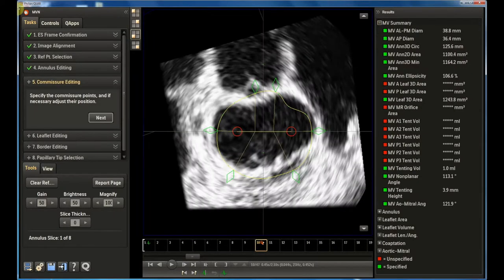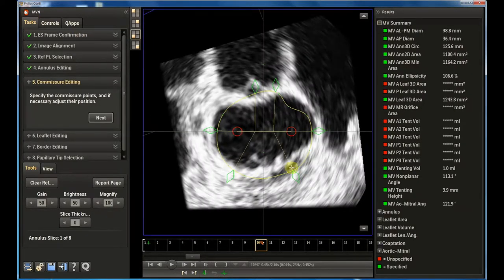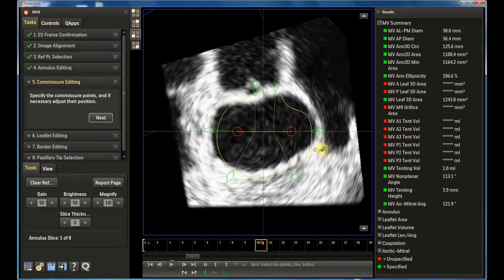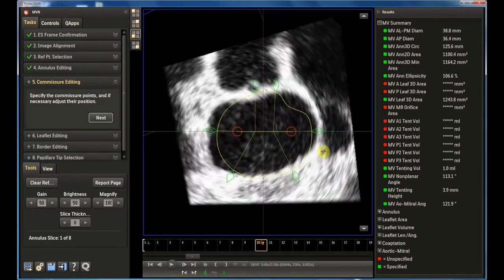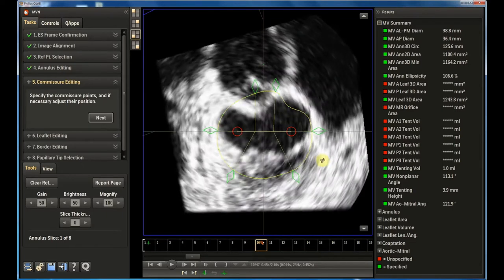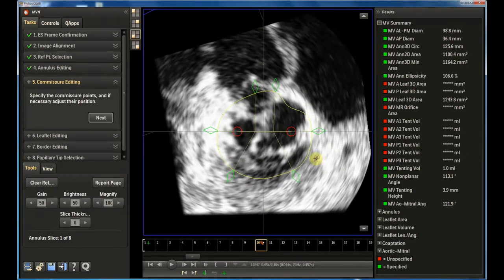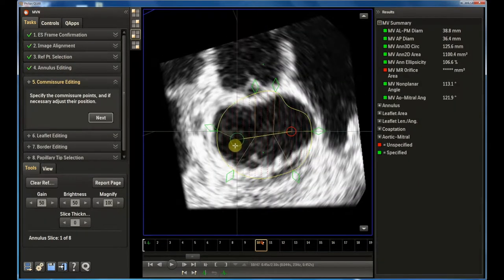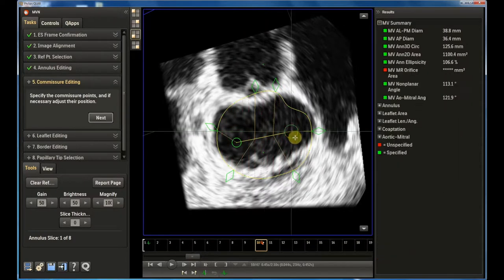The fifth step is commissures editing. There is a problem here since the commissures aren't always easy to recognize. It is possible to scroll down half the image to guess their position.